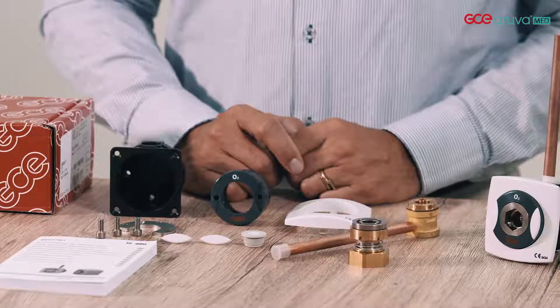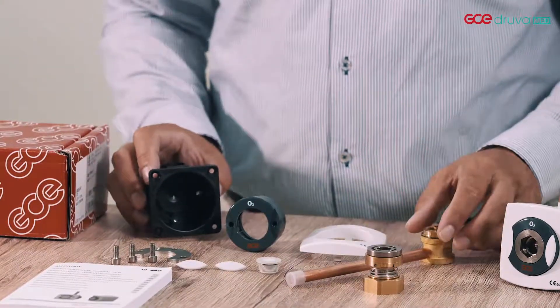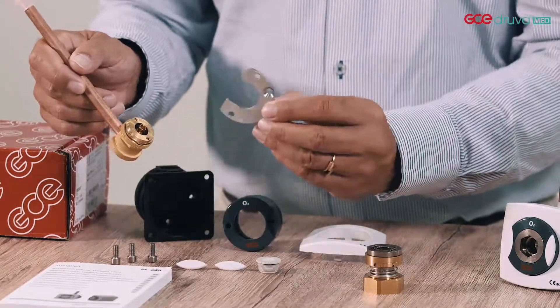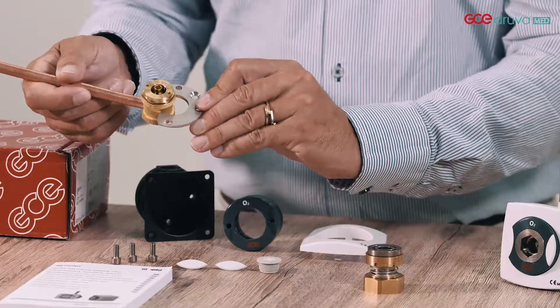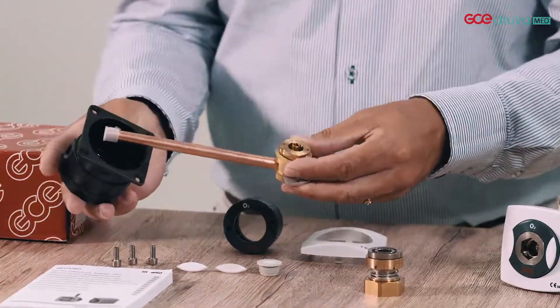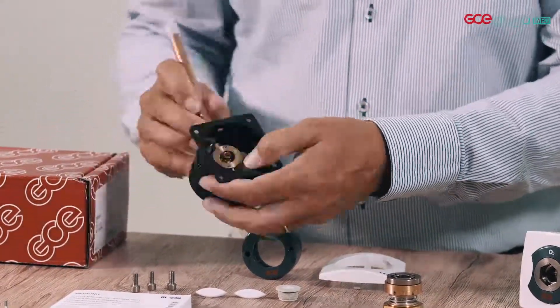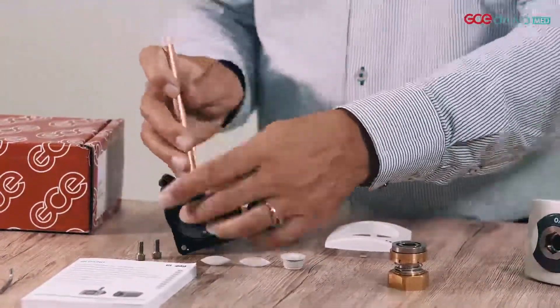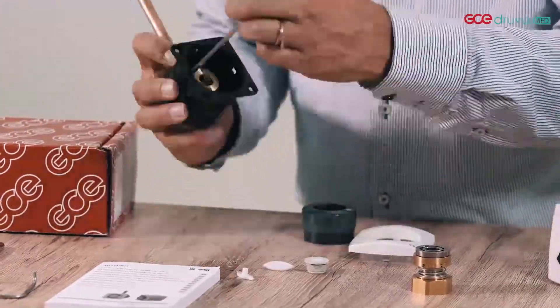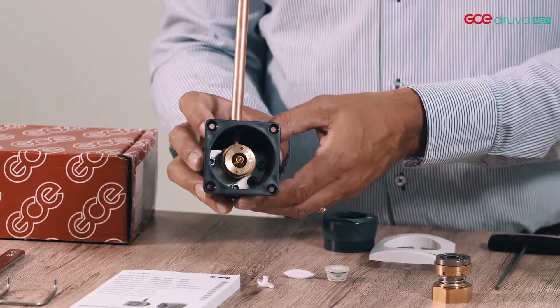I will now show you the assembly of the first fix. You take the housing, first fix, and mounting plate. This is the assembly of the first fix.